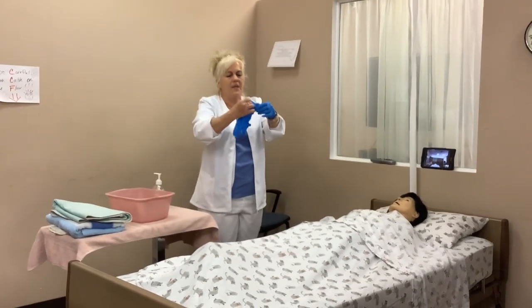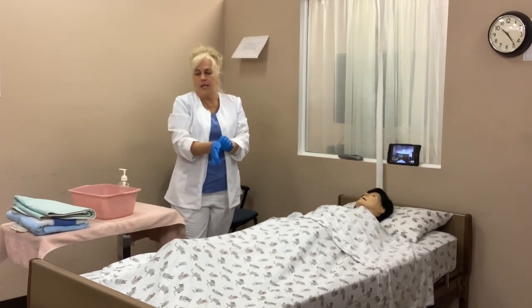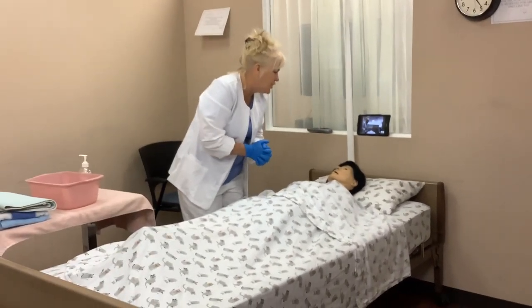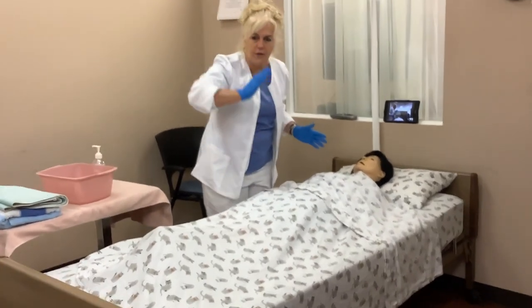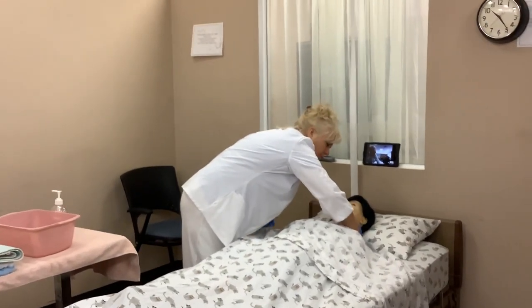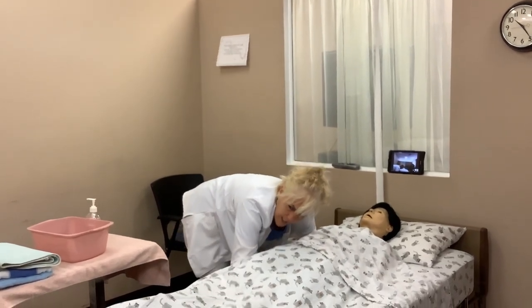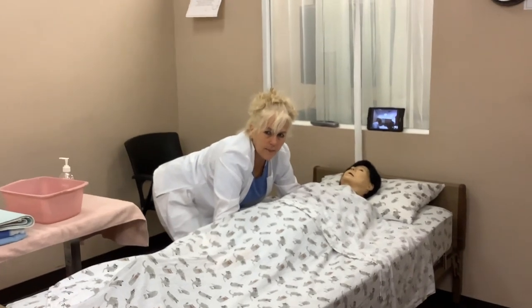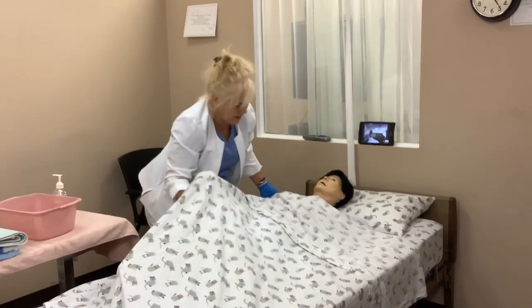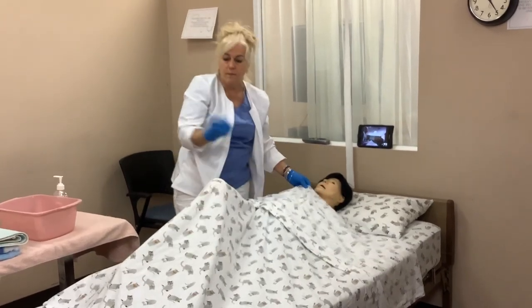The first step is to protect the bed. For this, we're going to move the patient to the side. Okay, Mrs. Smith, right now I'm going to move you to the edge of the bed. With the free hand — the hand farther from the head — after three, I'm going to tilt your head. Put your hand on the shoulders, then the other hand on the leg. Use appropriate body mechanics. After three, I'm going to move you to the edge. Then bend the knee, close the arm.